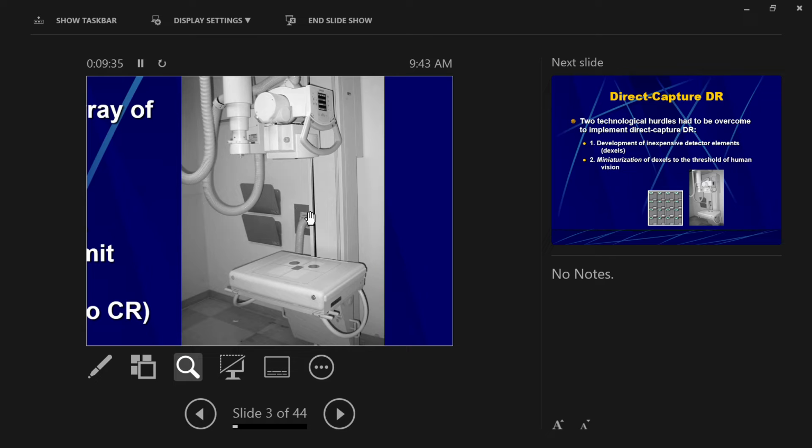That electric current, we have a preset current quantity, that when we get to that current, the exposure timer is shut off, right? We can activate all three of these cells to all work in unison. We can activate the two, in this case circular, often they're all rectangles, or just the single middle rectangular cell. That's the type of control this is. We call it automatic exposure control.